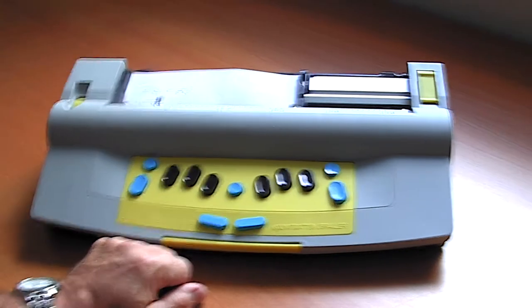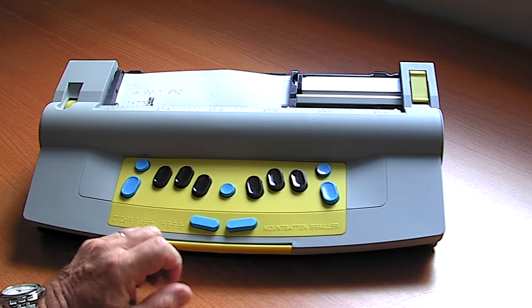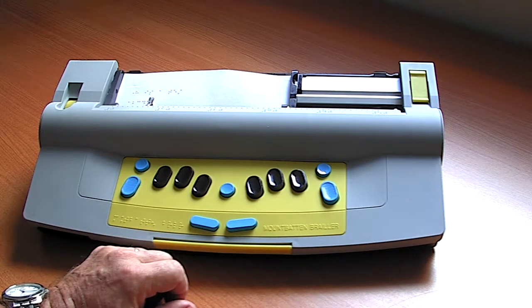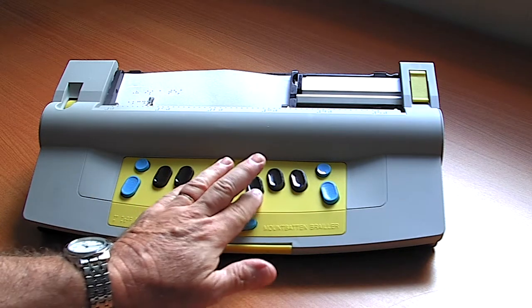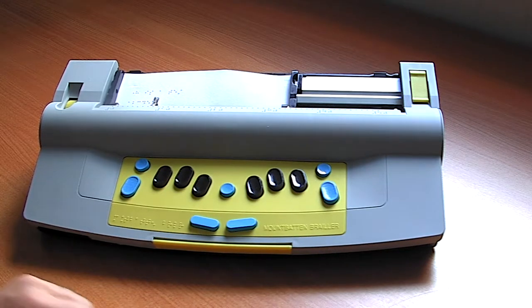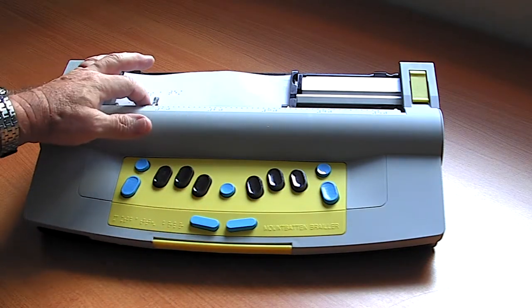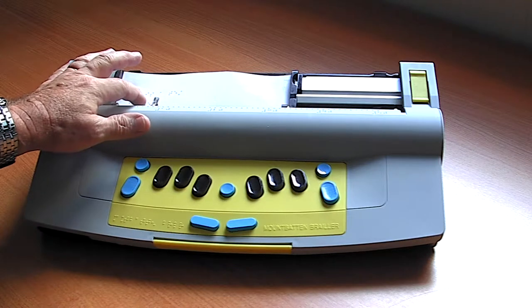It's an interactive device with speech feedback — as we press the Braille keys it will also be spoken. For example, if I form the letter C, the machine will say 'C'. I can adjust the volume or wear headphones, and this way I can immediately get feedback as to what I have just typed.